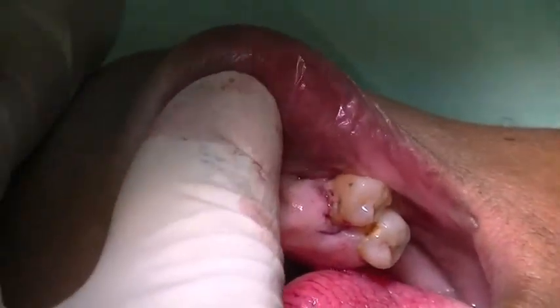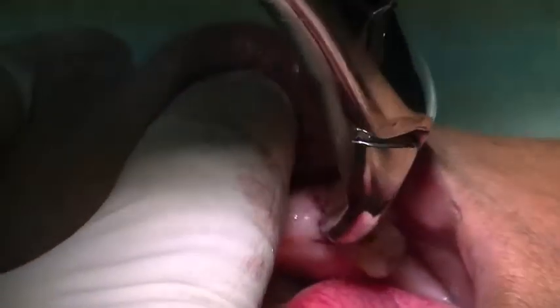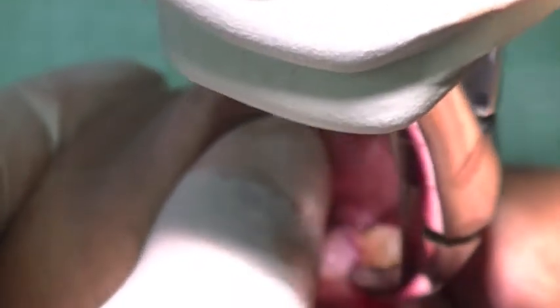So we're going to continue the extraction, universals, just to pick up the tooth. You can see how loose it is. We're just going to deliver buccally. No, you're fine. No problem.